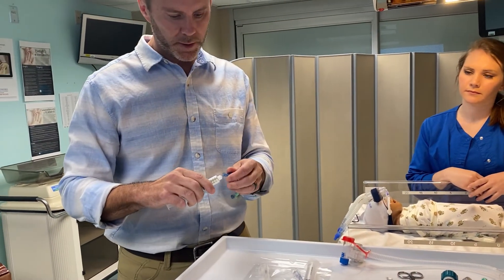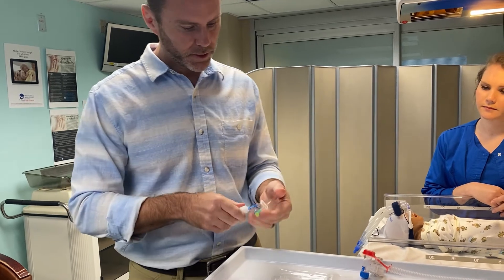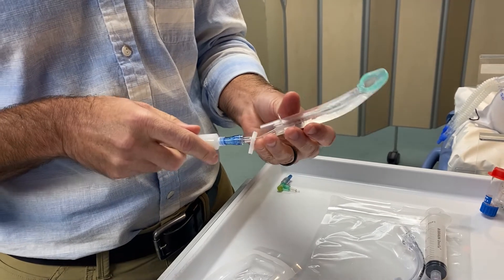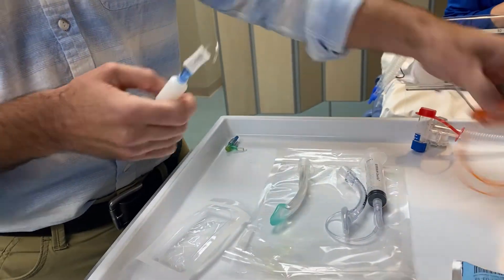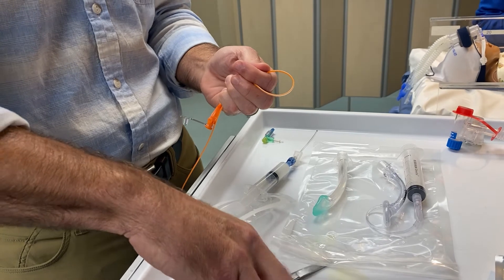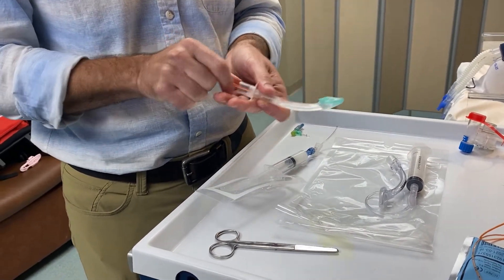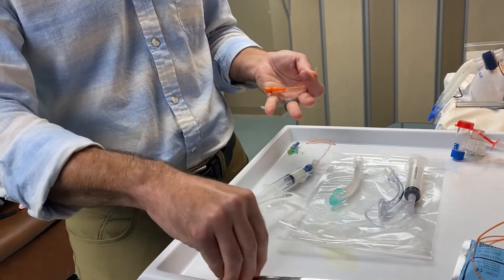We're going to demonstrate how to cut the tubing just right. Connect that to the surfactant and make a nice little cut at the end — now we have a piece of tubing that perfectly fits down our supraglottic airway. You can also use other tubing such as a feeding tube. You want to cut it so that it doesn't go all the way down the device but stops right near the end.